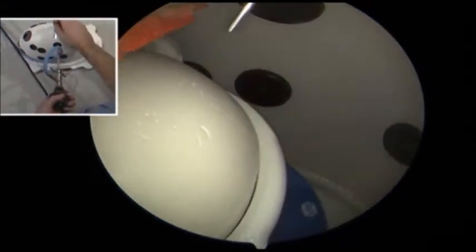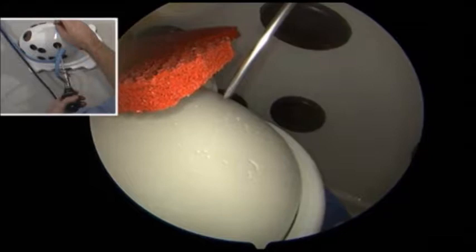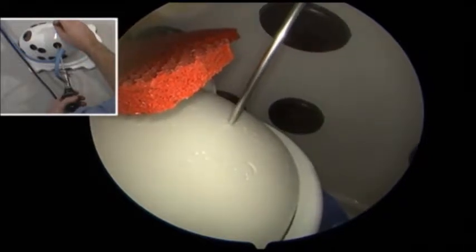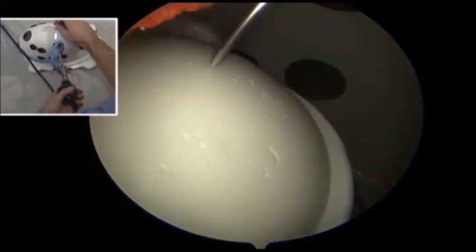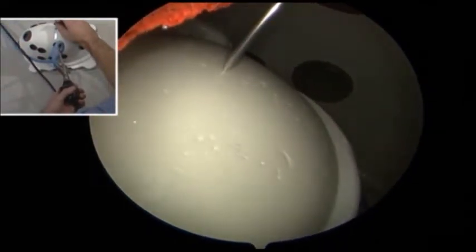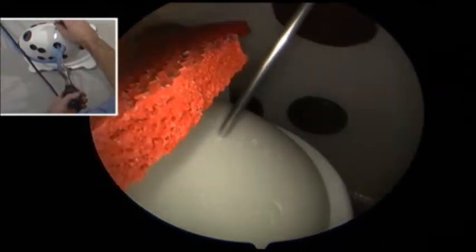And so we'll come up here to try our accessory lateral portal. If I place it here, this is probably too steep of an angle. If we come here, we're going to try to optimize at about a 45-degree angle. So I like that position.